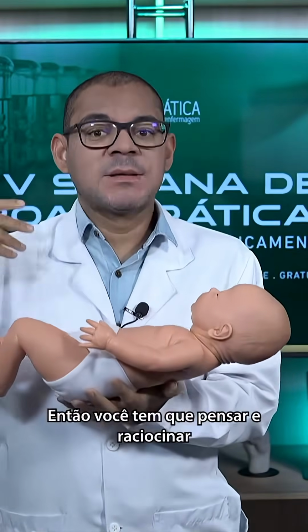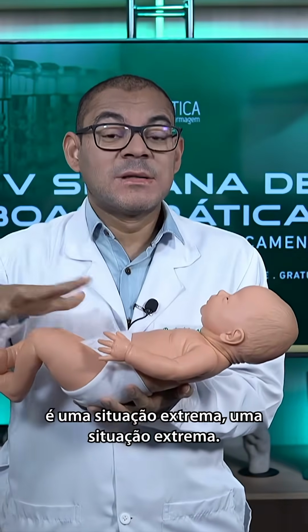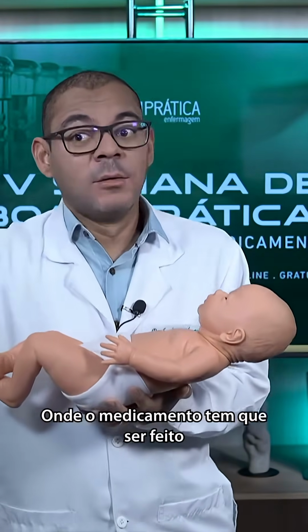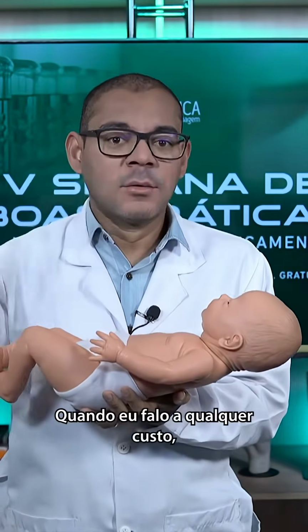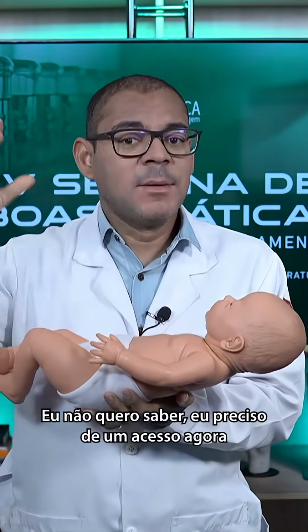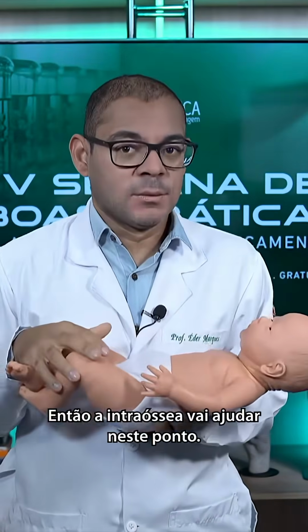So, you have to think and reason that when you're going to use the intraosseous route, it's an extreme situation where the medication has to be given immediately, at any cost. When I say at any cost, I mean this. I don't care. I need access right now, period. So, the intraosseous route will help in this situation.